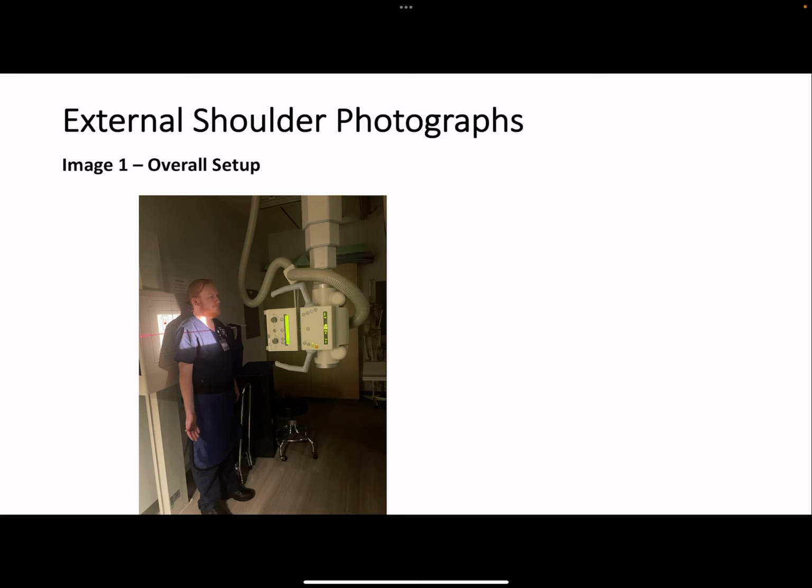I escorted the patient into the radiography room. I asked him his name and date of birth. I then asked him to remove any artifacts that could compromise the X-ray images. I then verified the body part of interest and asked if he could perform specific arm movements with as minimal pain as possible to give me a better avenue of approach and positioning for successful imaging. I then donned the lead apron for his safety shielding.